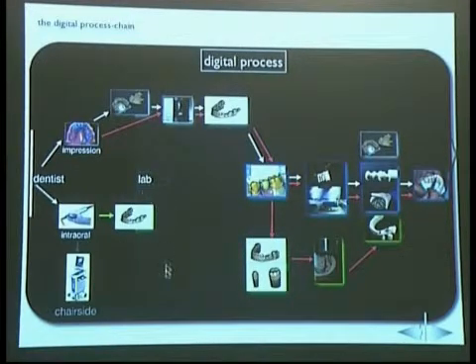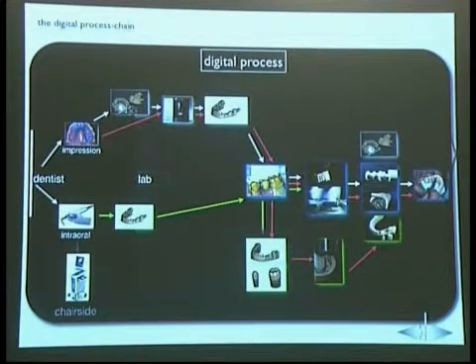And then taking the data there, going to the design, and the step stays the same as in the digital process before. If we make an impression scan, we need a model. Same step, we need to go to the model. We need to manufacture the models, put them together also with the work afterwards, and then we go to the veneering. So these are the digital processes, and I want to start with the first one, with normal scanning.